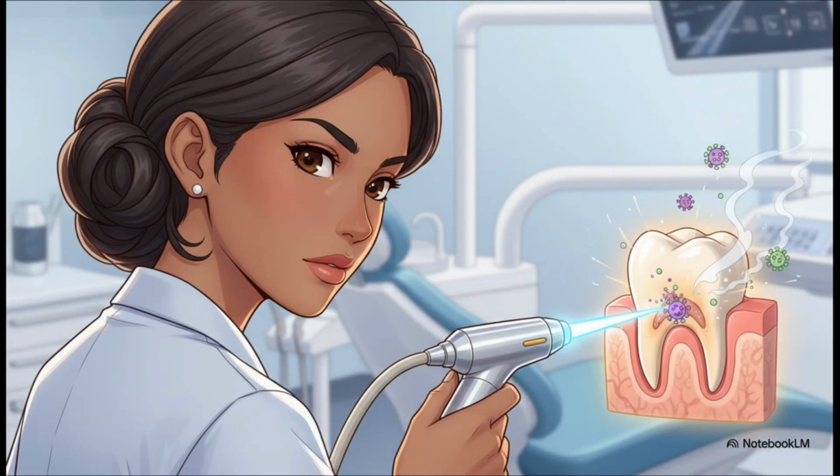That incredible precision makes lasers fantastic tools for soft tissue surgery. We're talking about things like gingivectomies, where you're reshaping the gums, or even removing pigmentation. But one of the biggest advantages is the bactericidal effect. The laser literally sterilizes the area as it works. And what does that mean for your patient? Well, it often means less pain after the procedure and faster healing than you'd get with a traditional scalpel.